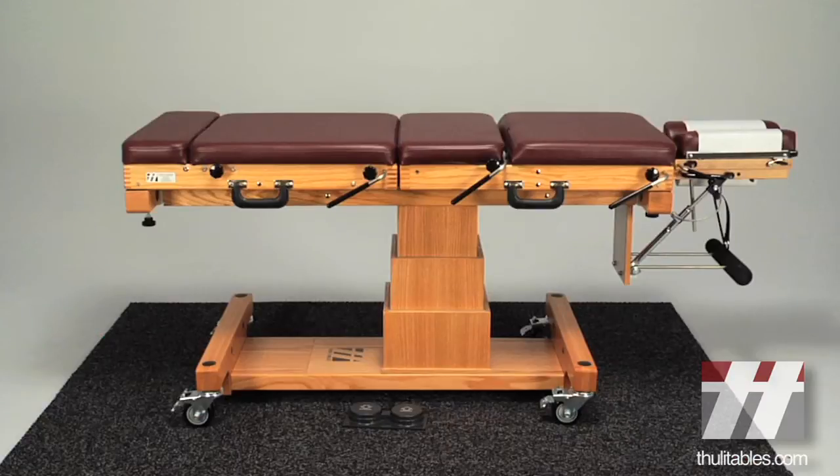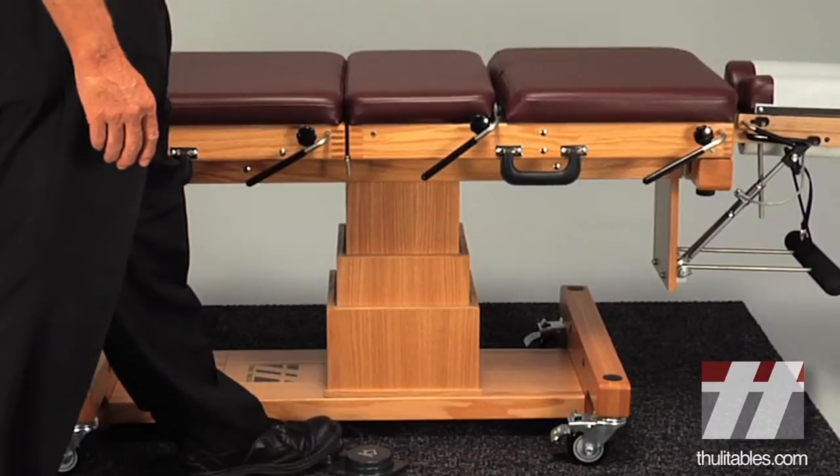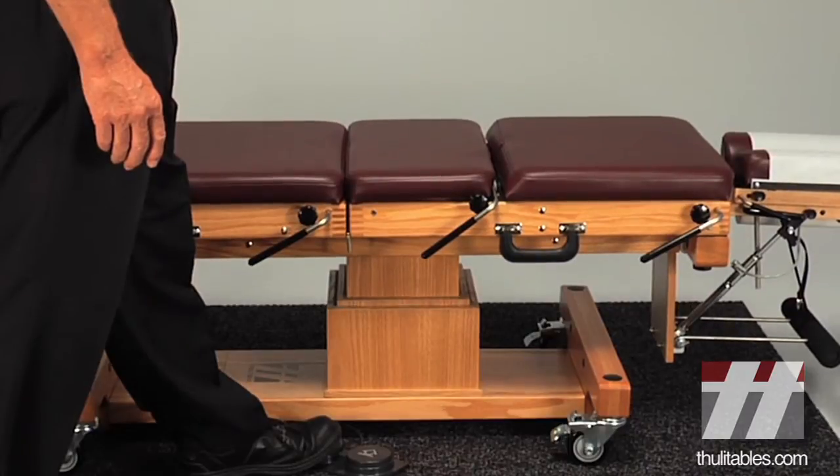The table is now ready to be used in the office. The conversion base gives the table a 10-inch vertical range. Simply depress the up and down foot switches to raise or lower the table. It can be raised to approximately 28 inches and lowered to approximately 18 inches.